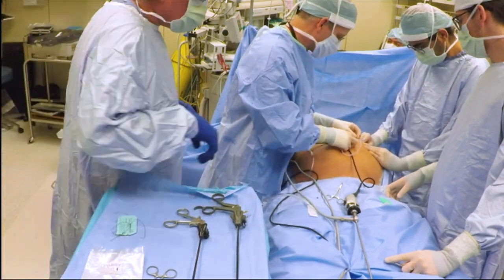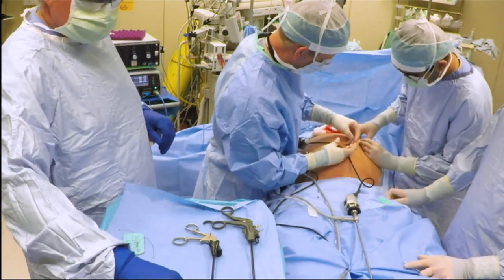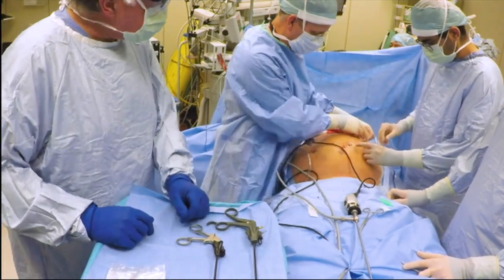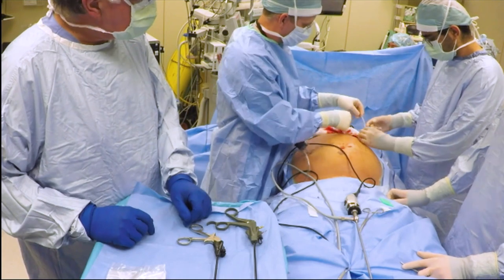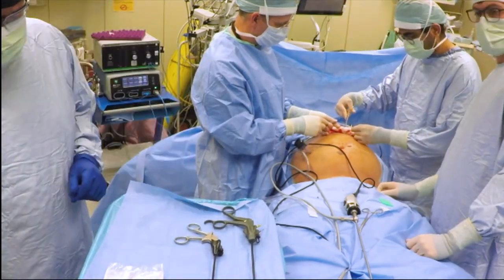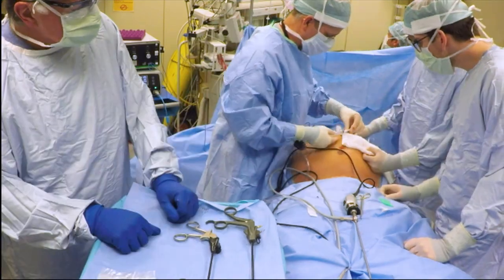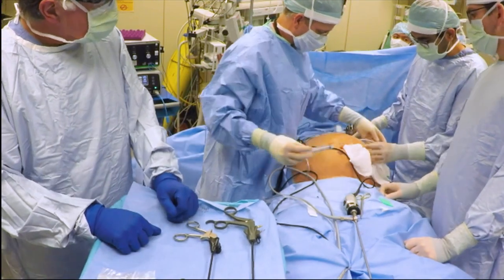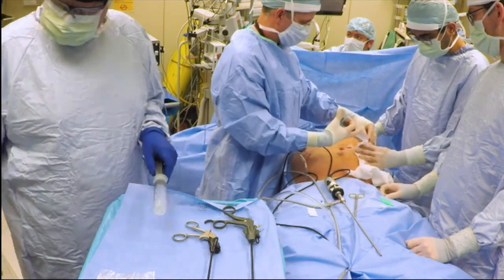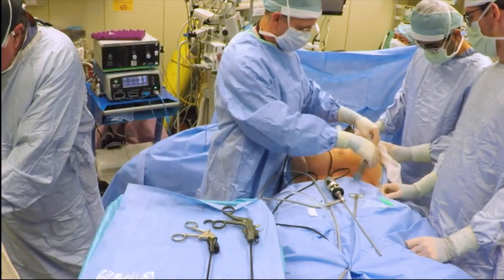We spread our passageway to help ensure the superficial cuff does not get stuck. We then trim the catheter and attach a plastic connector to our catheter. Catheter patency is assessed using sterile saline — we're looking for free passage of fluid and no flow-limiting kinks.